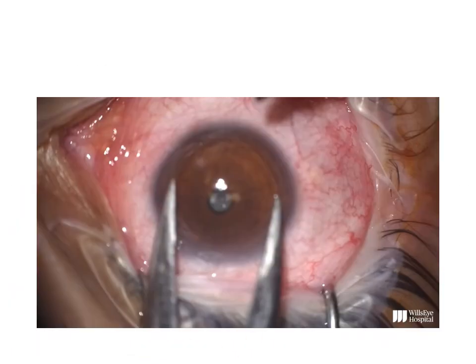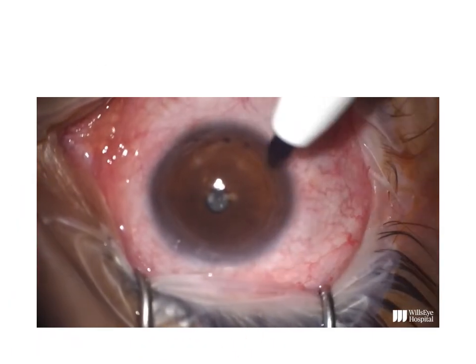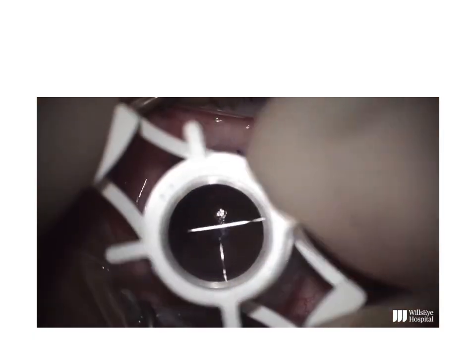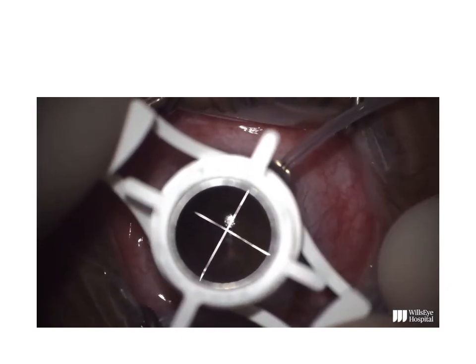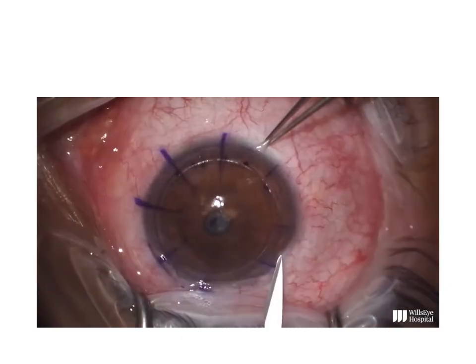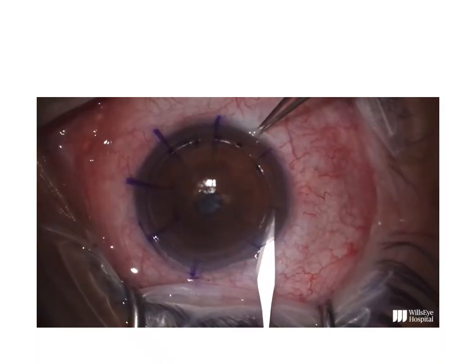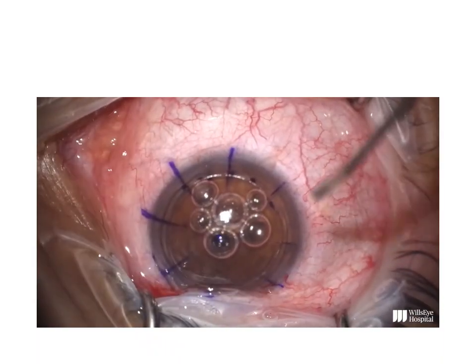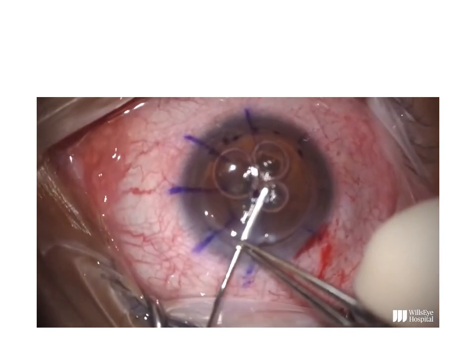So just coming on to the video now, they have marked the trephination area. That's the trephine, making the groove in the stroma up to a depth of say 300 microns. A side port is made to enter the anterior chamber. Air is injected.